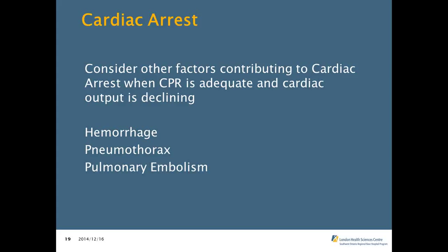So again, that good, clean capnography reading and its sole use to diagnose something is why we can't use it, because there's so many variables that do occur. One question that has come in is, what would you see in the waveform of someone suffering from pulmonary embolism?